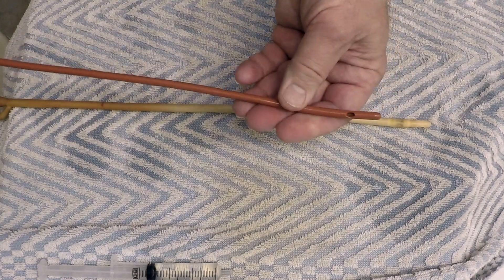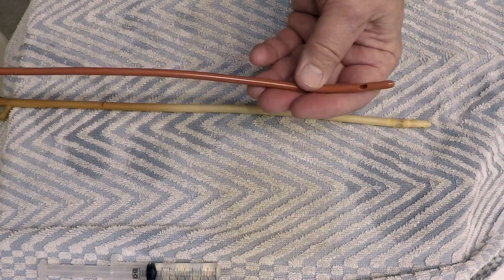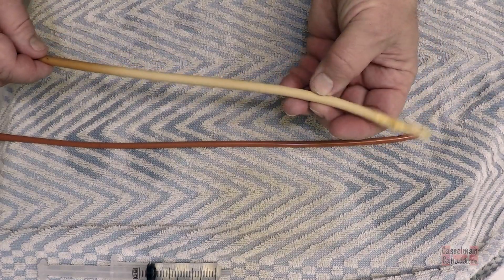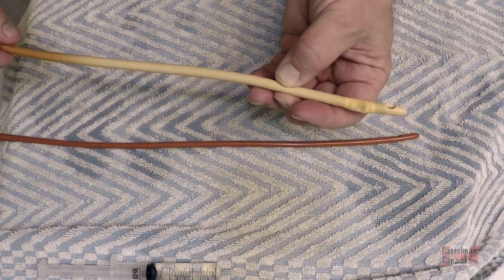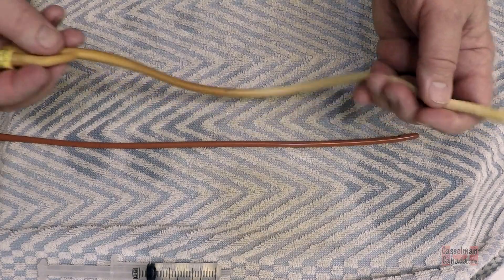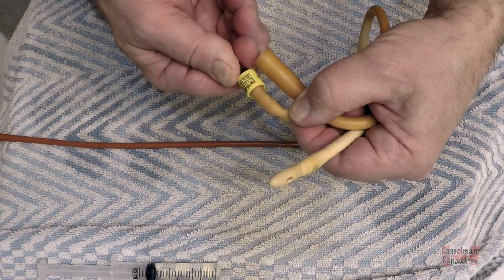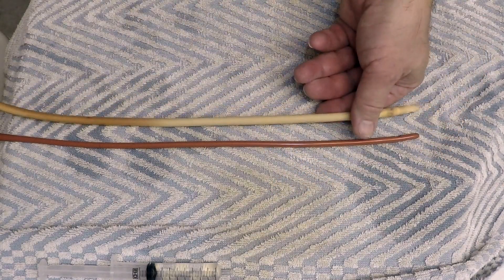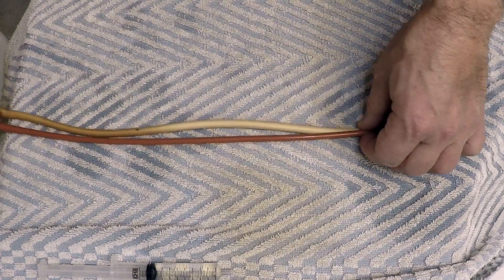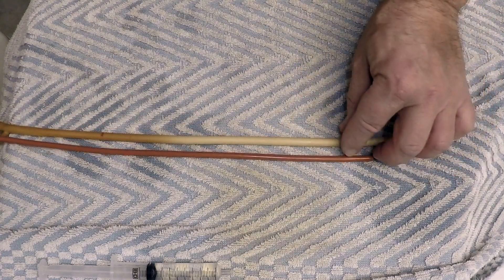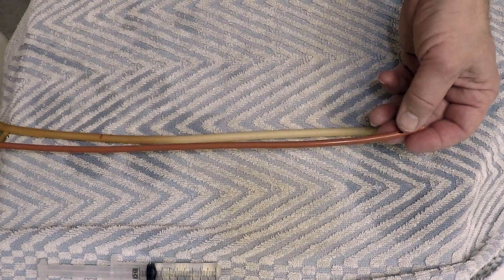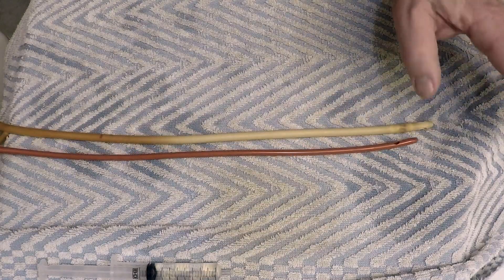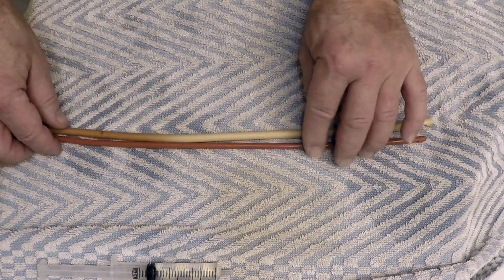This is the old one that I was using a week and a half ago. This is a number 14. From the look of it, this looks like about a number 22 or 24, or if they even have that numbering that big. It says here it's a number 20. Okay. So the one they gave me, I have a number 18, so it's halfway in between these two. I have a number 18 that I'm going to be using and then I'll have to buy some more. I have some smaller ones, but I want to get it as big as I can.